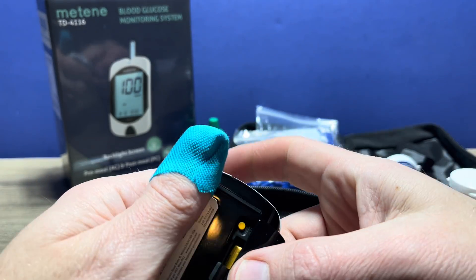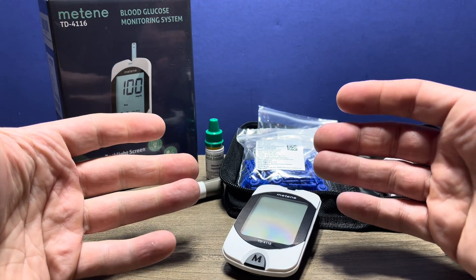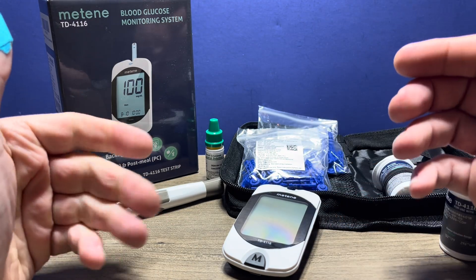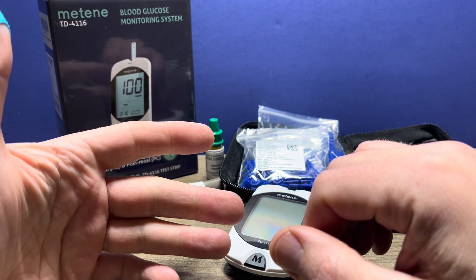So we can go ahead and put the battery door on. Then to prepare your hands you need to wash in warm soapy water, thoroughly dry them, and then clean the area with an alcohol swab. Ensure that that dries properly.